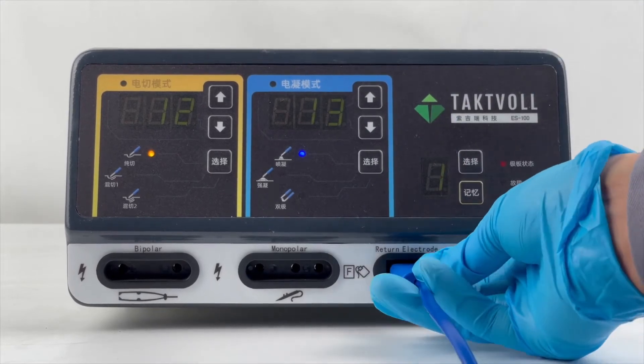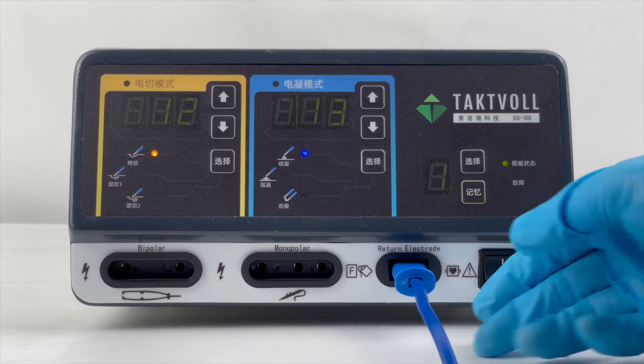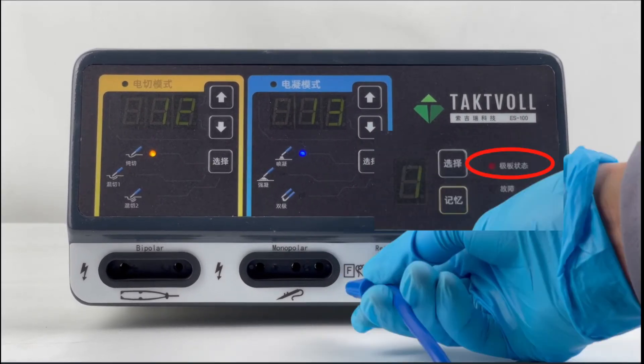After connecting, we can see that the Indicator Light of the Neutral Electrode turns green. When the Neutral Electrode is not connected properly, the Indicator Light is red.